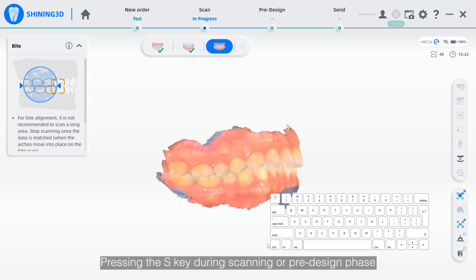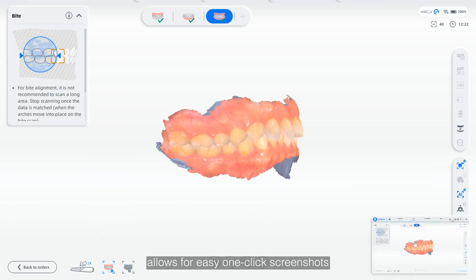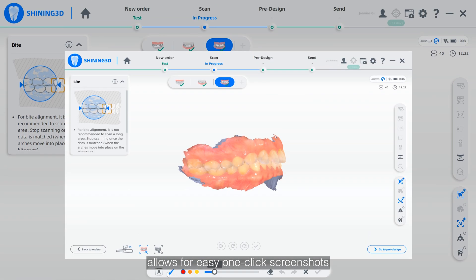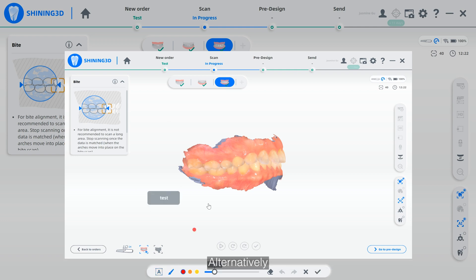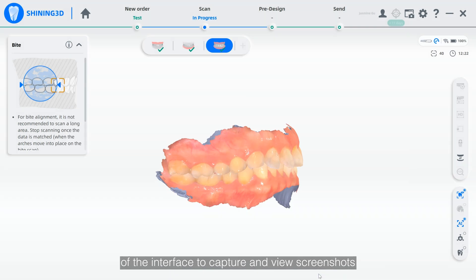Pressing the S key during the scanning or pre-design phase allows for easy one-click screenshots. Clicking on the generated screenshot allows you to annotate the image. Alternatively, you can click on the screenshot icon in the top right corner of the interface to capture and view screenshots.